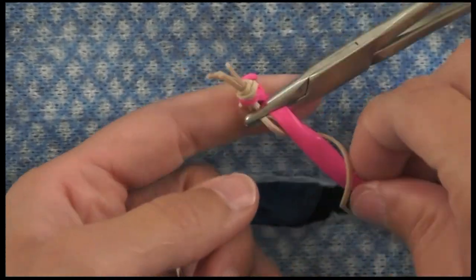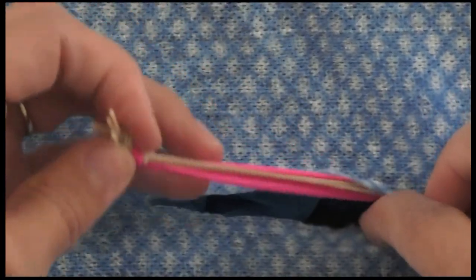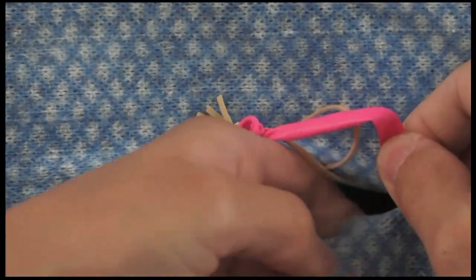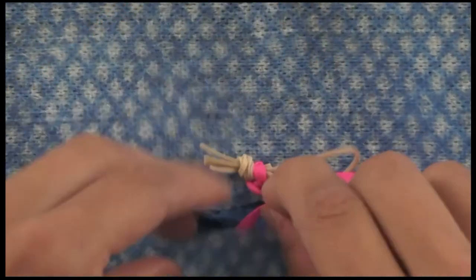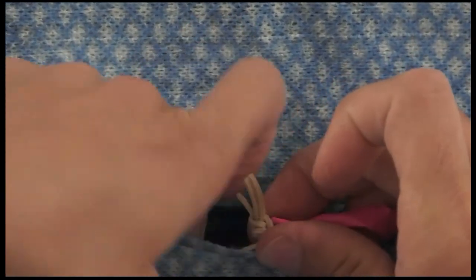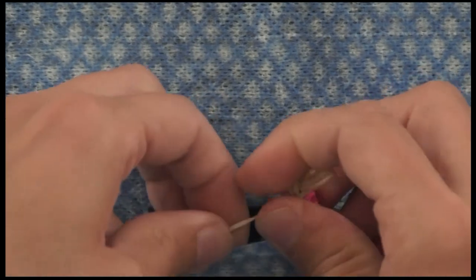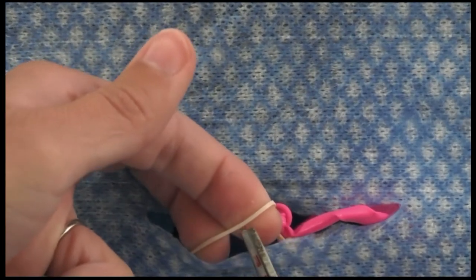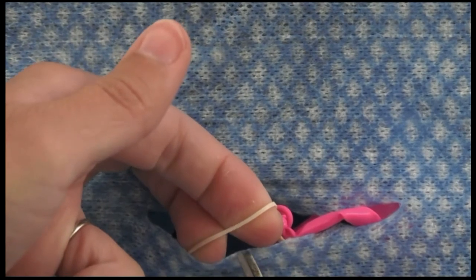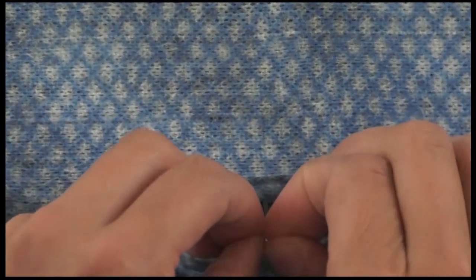Follow the uterine horn down to the body and across to the other side, scoop it up with your fingers, then follow the uterine horn all the way up to the second ovary. Find the suspensory ligament — palpate it, try to break it; if not successful, give it a snip with scissors. Apply your fingers very close together so you only apply force on the structure you want to break and not the other delicate tissues.